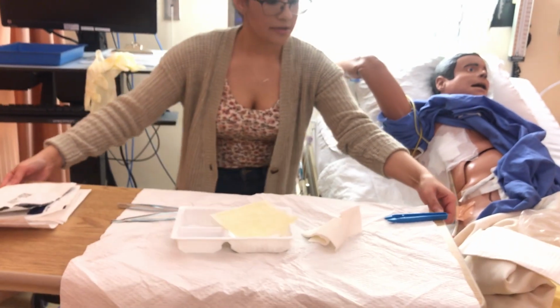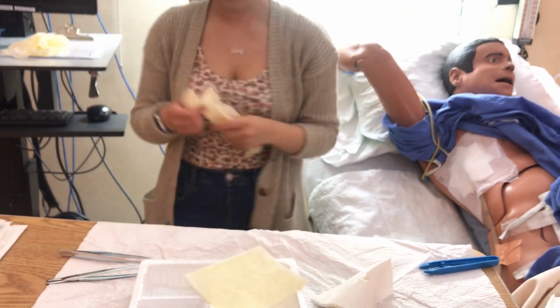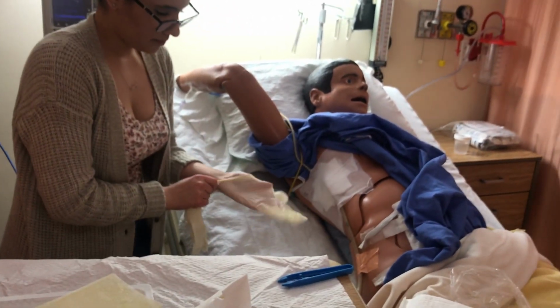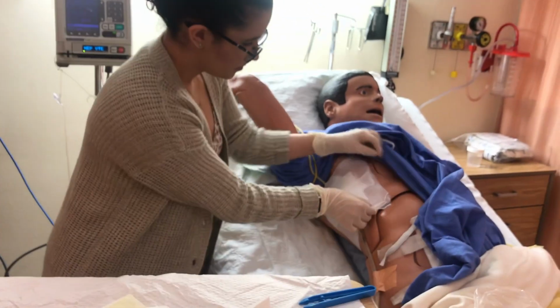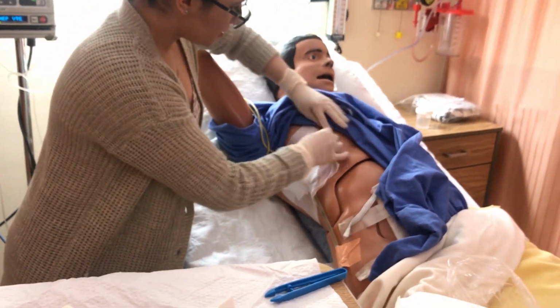So now I'm going to don some clean gloves and get rid of this old dressing. 2,000 mils, and our formula is amino acids, 100 grams, dextrose 200 grams, lipids 50 grams, and our electrolytes are sodium 120, potassium 60.